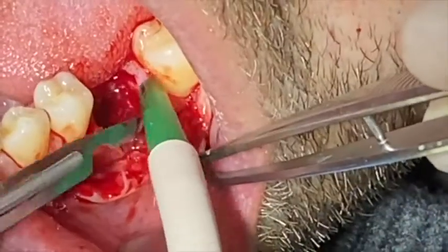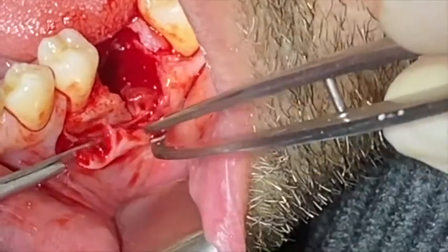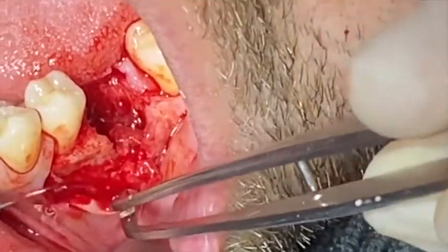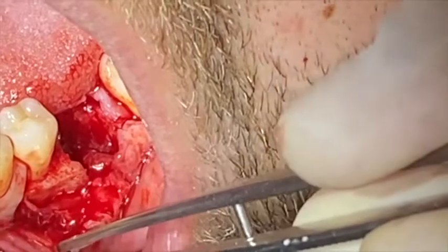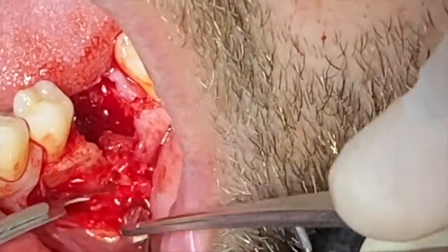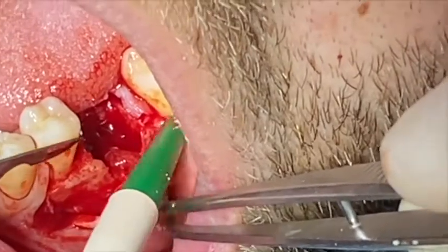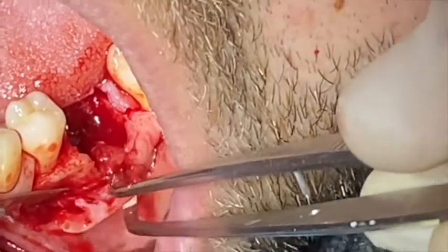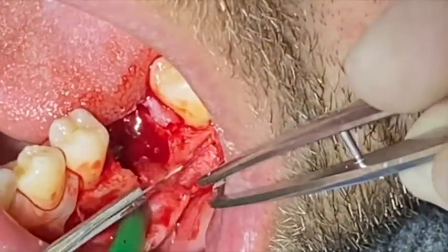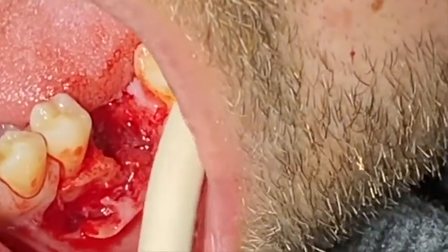Once I find the area where I have the very thin buccal flap, I want to preserve it and avoid any dehiscence, any fenestration, and any tearing of that flap. So I'm going to divide the outer flap from the inside granulation tissue. As long as that granulation tissue is not affected or infected, I can keep it at the inside of the flap in order to gain some thickness of the flap.